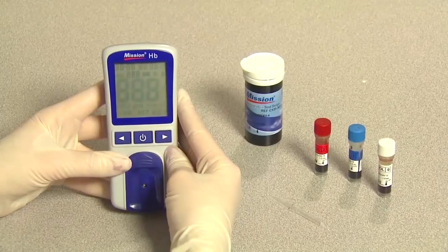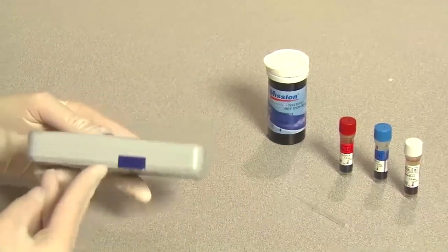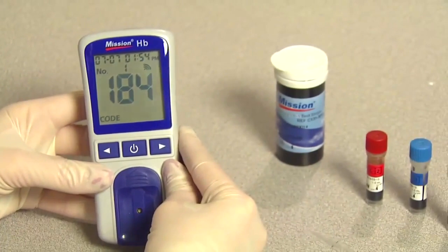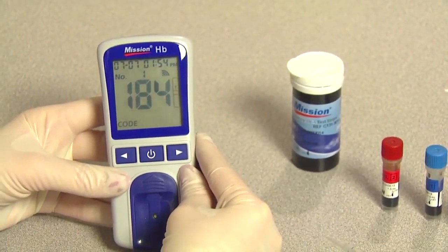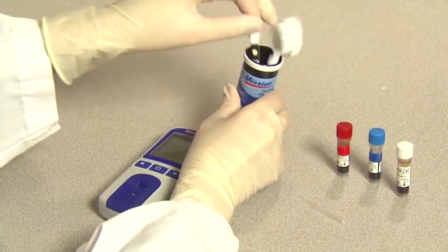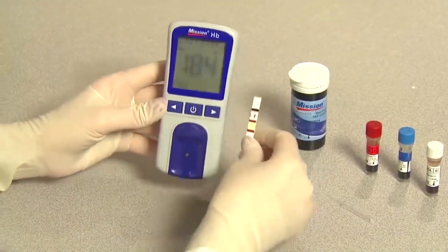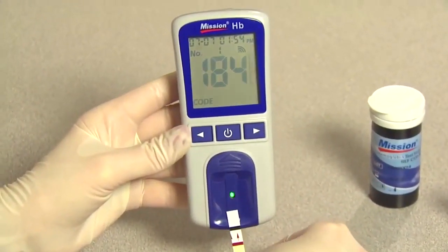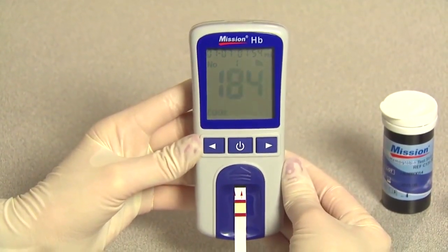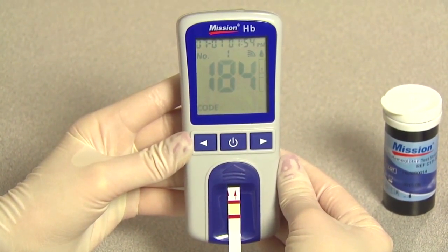Turn on the meter. Check that the code chip number on the LCD screen matches the inserted code chip. Wait for the meter to flash the test strip symbol. Insert the strip completely into the strip channel in the same direction as the arrows printed on the test strip. The blood drop symbol will flash when the meter is ready for the specimen to be applied.